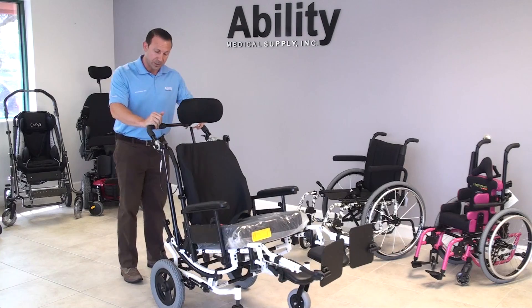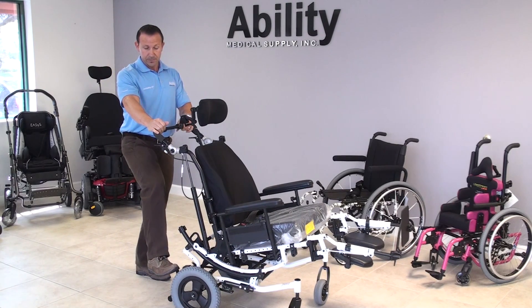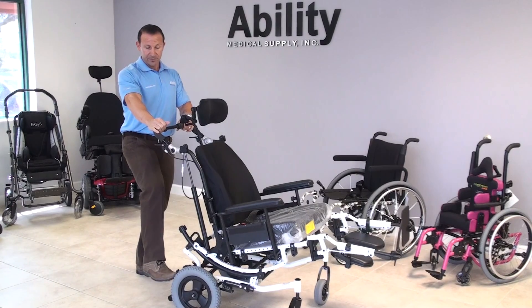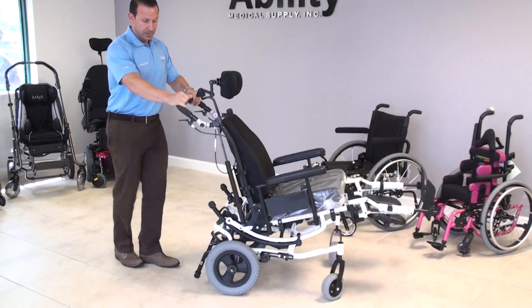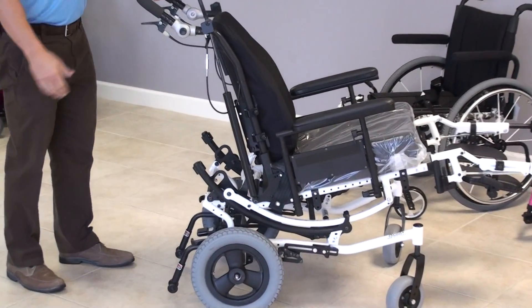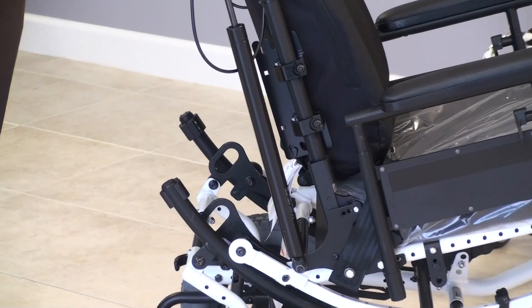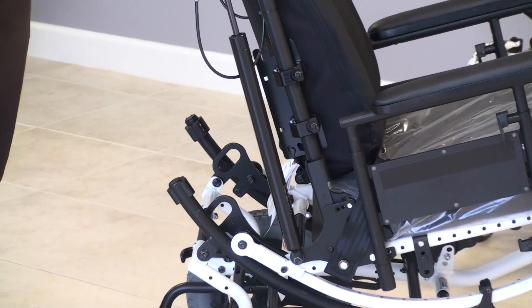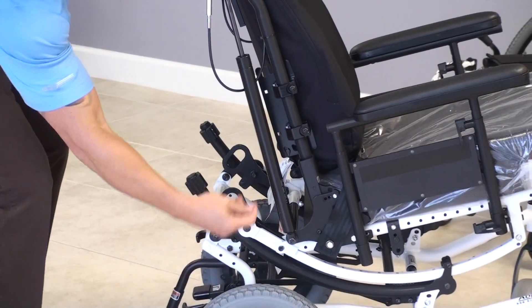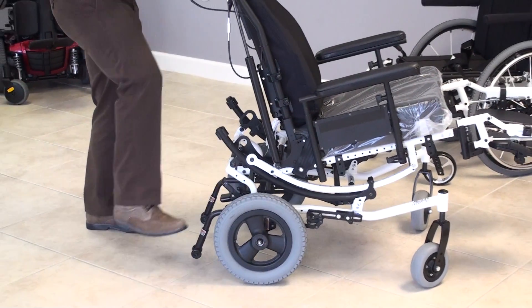One other thing I want to show you is the foot-operated brake system. You can see I'm pushing on the brake with my foot — disengage, engage — it locks in. This is another great feature that protects the caregiver from any back issues, having to bend over to disengage and engage with their hand. Really user-friendly, really good system.